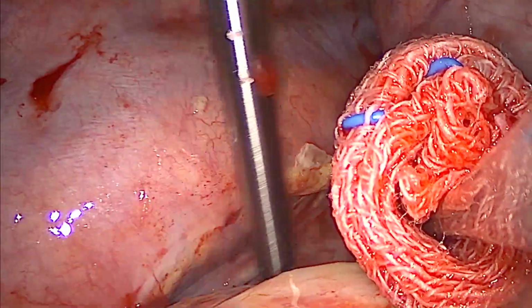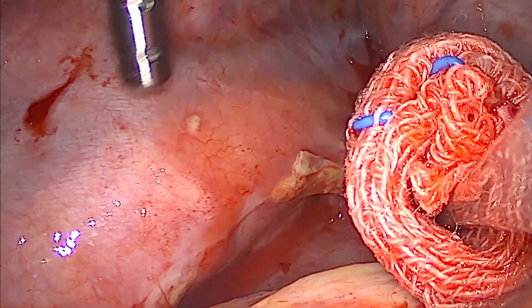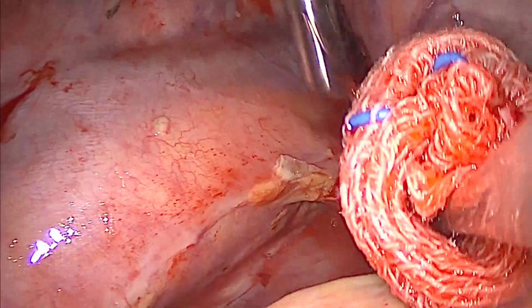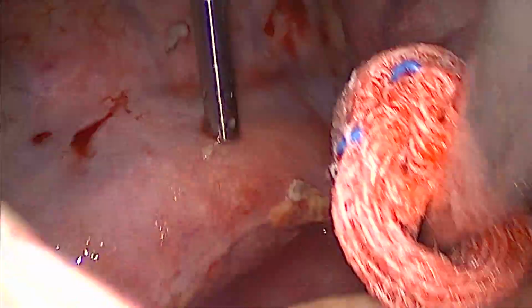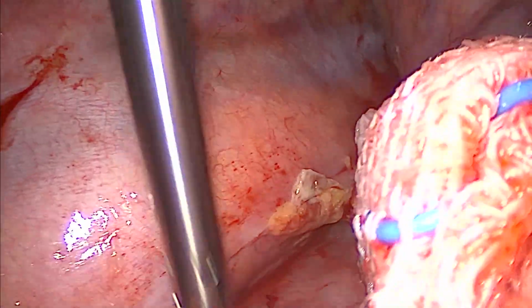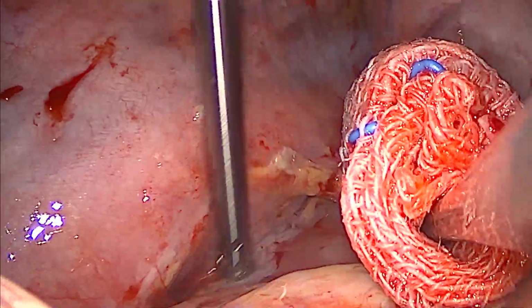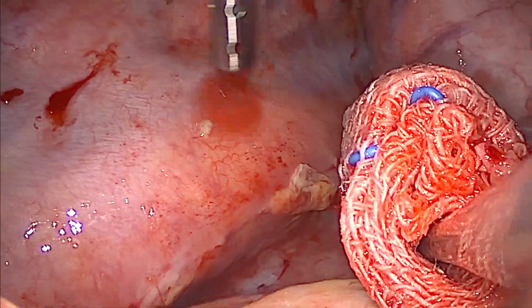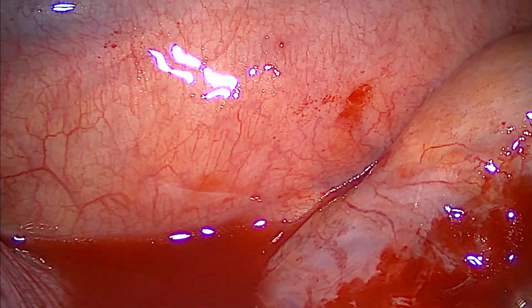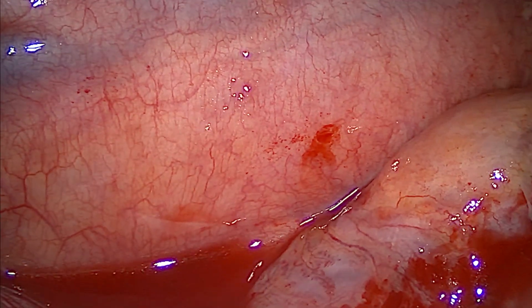This patient underwent two-stage oesophagectomy for a lower oesophageal tumor a few days earlier, and during the surgery, unfortunately, the thoracic duct injury was not picked up. We have had it a couple of times before this, but during the surgery we were able to pick it up and ligate it. We don't ligate them routinely; as you would know, the jury is out there, and half of the people do ligate them and others don't.